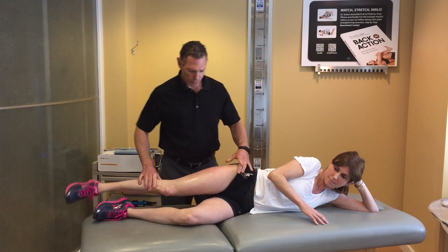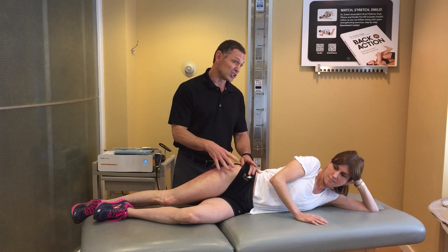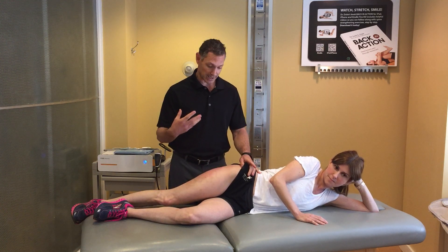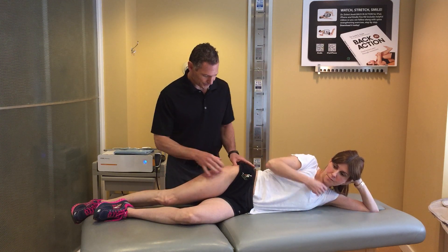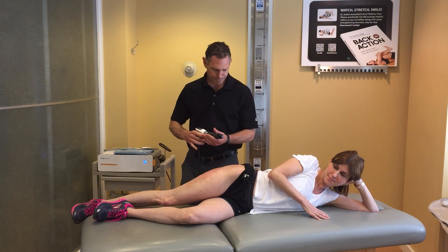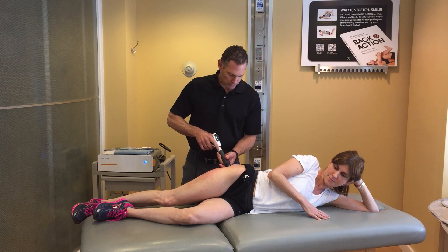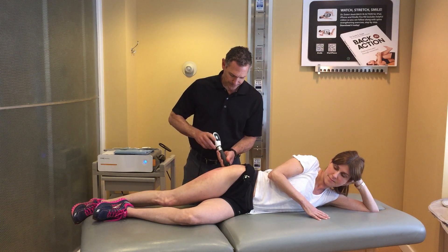Now EPAT is a radial shockwave that delivers an impulse or pressure wave that dives much deeper into the tissue than we can get with our hands. I have it set up on an appropriate setting and I'm going to start first right at the base of that glute medius.